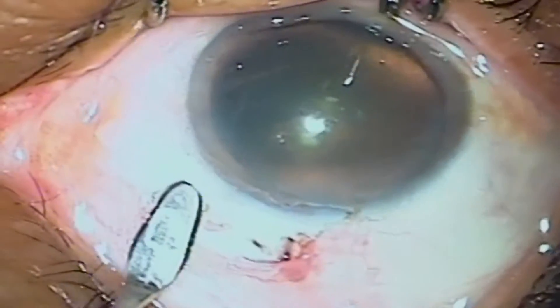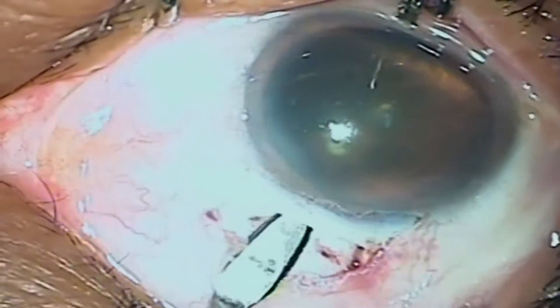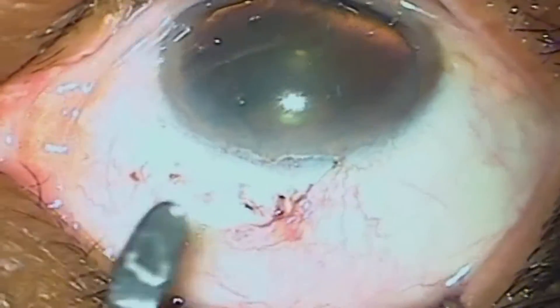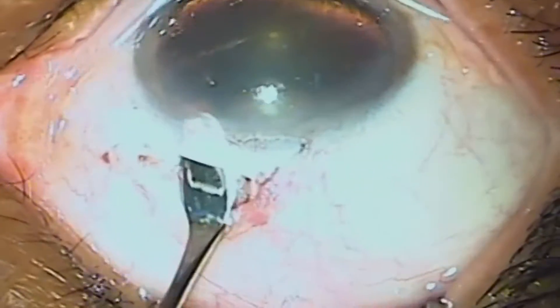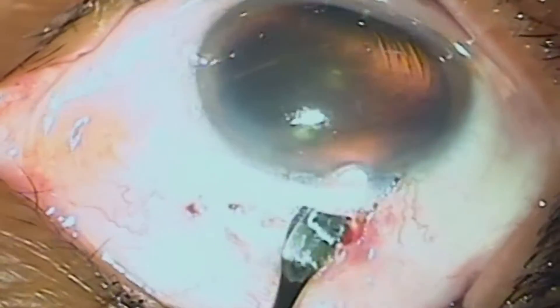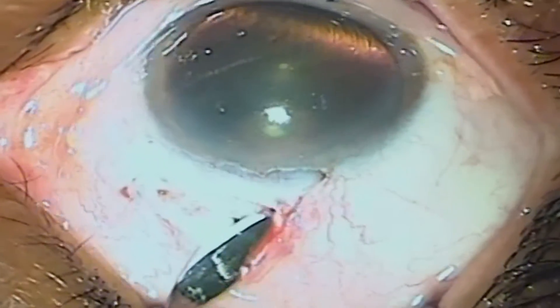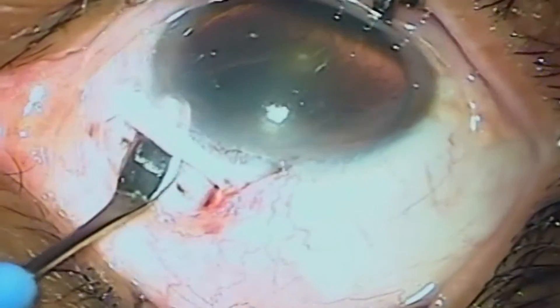In this video we will discuss a few points to take care of to bring out extremely good post-op results the next day — the result desired by any cataract surgeon who cannot afford femto machines or high-end phaco emulsification systems. Number one: know your SIA for all incisions at all axes.